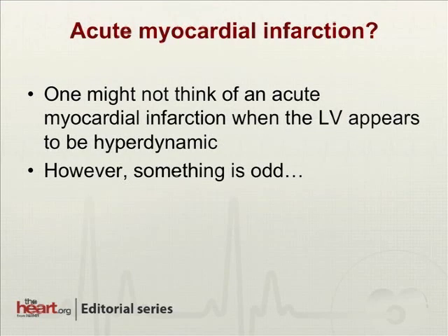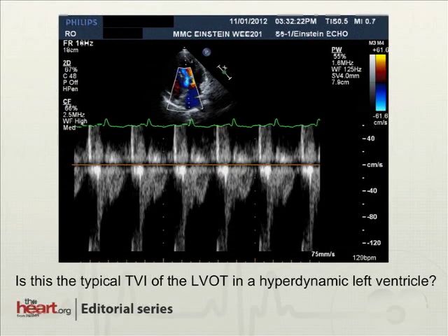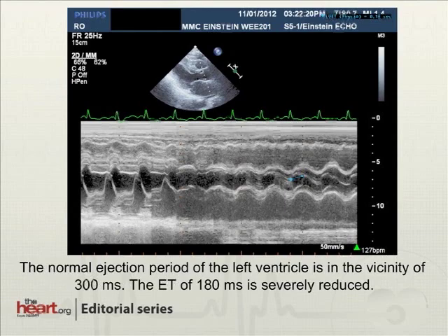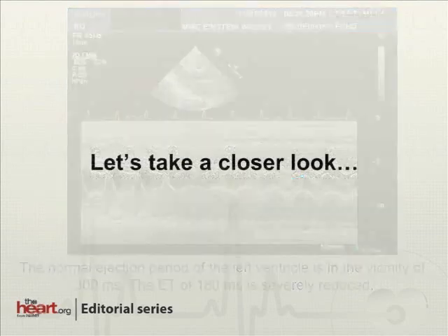Acute myocardial infarction. When first learning to look at echocardiograms, one might not think of an acute MI as causing the left ventricle to appear hyperdynamic. However, there's something odd here. Look again at the left ventricular outflow tract time-velocity integral — is this what one would expect with a ventricle that appears hyperdynamic with an ejection fraction greater than 75%? No, it's not. Typically the velocity should be higher and the width of the jet should be wider. If we time the ejection period on the M-mode of the aortic valve, it measures 180 milliseconds. A typical ejection period in a healthy left ventricle is closer to 300 milliseconds.